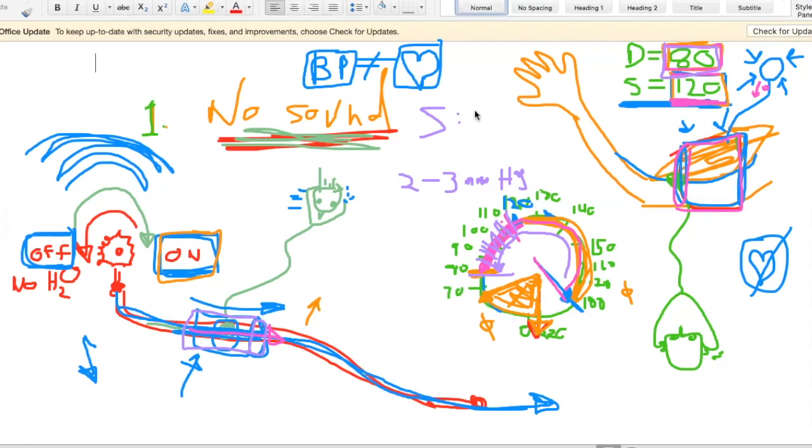So your systolic blood pressure is the first beat that you hear, the first beat. Now, that's different in some books. Sometimes they say the first auditory sound. Sometimes they say the first clearest beat, but we don't have accurate enough stethoscopes to determine. So for me, it's the first beat. And the diastolic blood pressure is when there's absolutely no sound anymore.